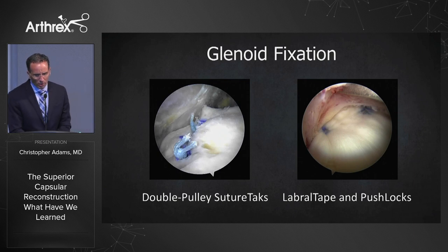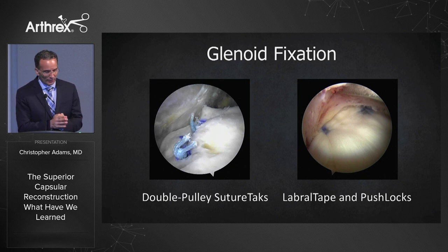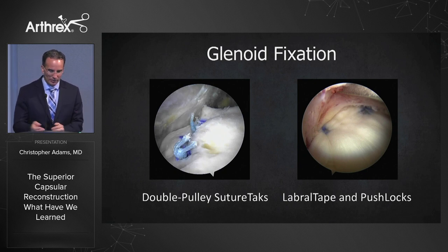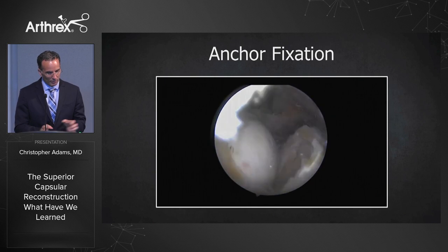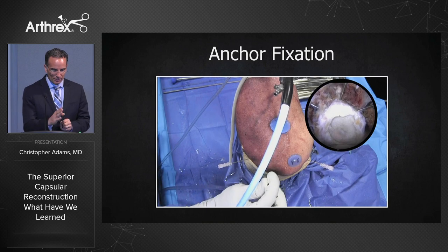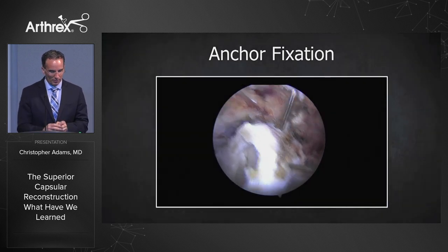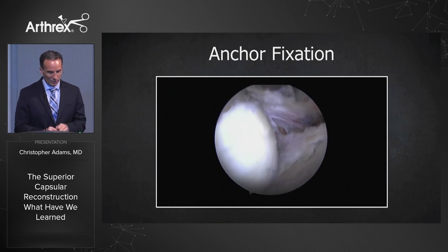Number four: with every construct there's a weak link. With the superior capsular reconstruction, it's on the glenoid. We've done all different types of fixation on the glenoid side — double pulley suture tacks, labral tape, and push locks. We wanted to show a relatively new advancement in glenoid fixation. In this cadaveric demonstration of a left shoulder, we made a large rotator cuff tear, placed three spinal needles representing the 10, 12, and 2 o'clock positions, and prepared the bone bed on the glenoid and greater tuberosity.